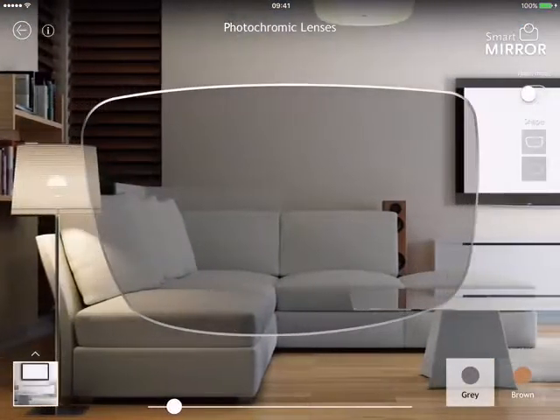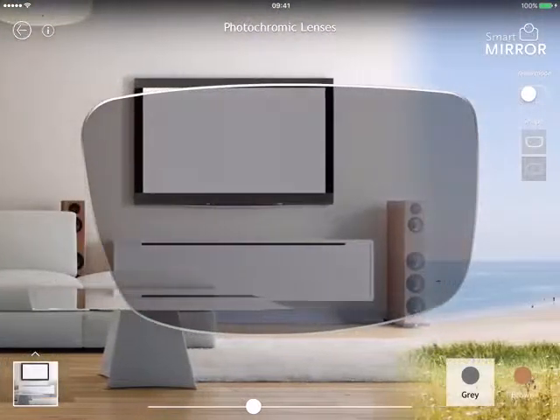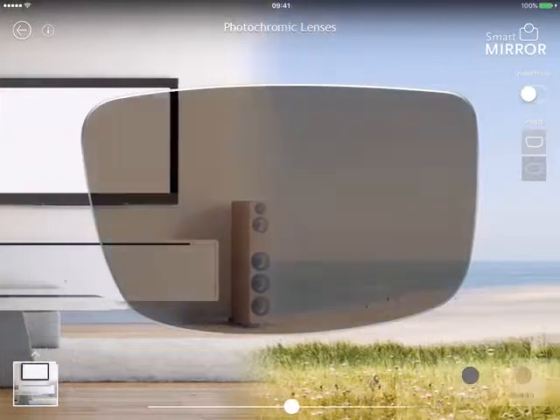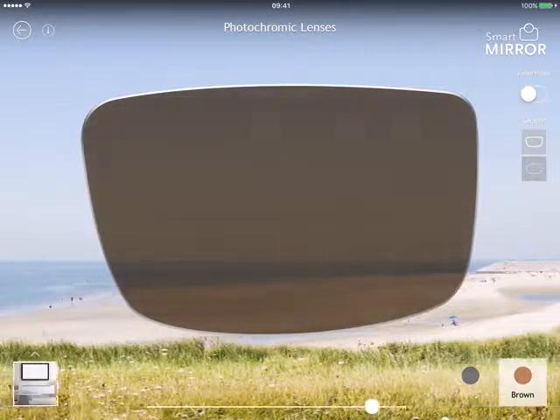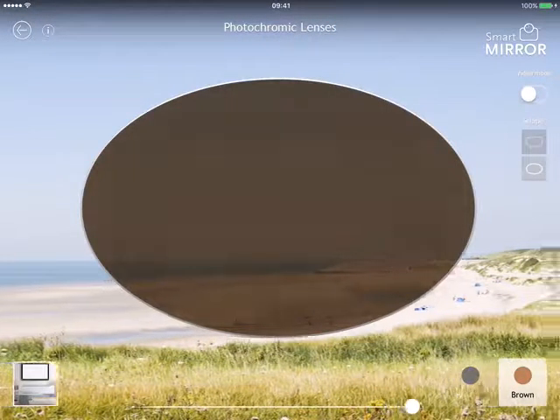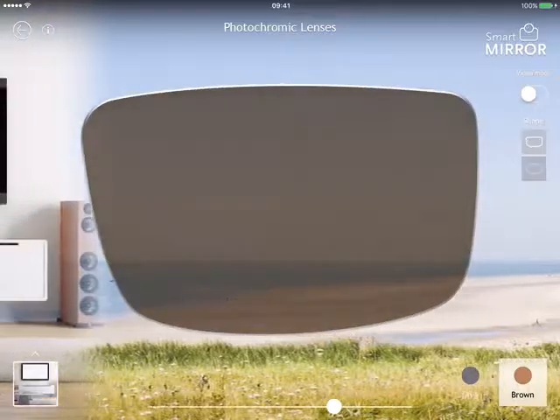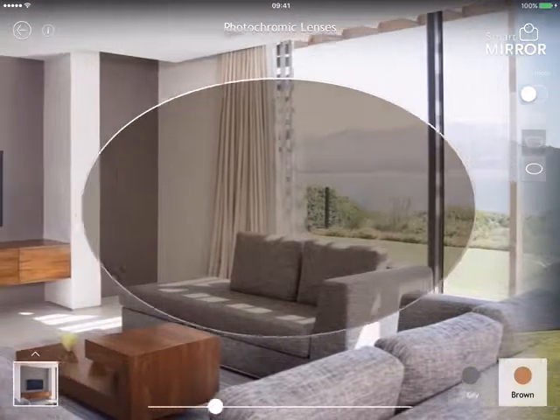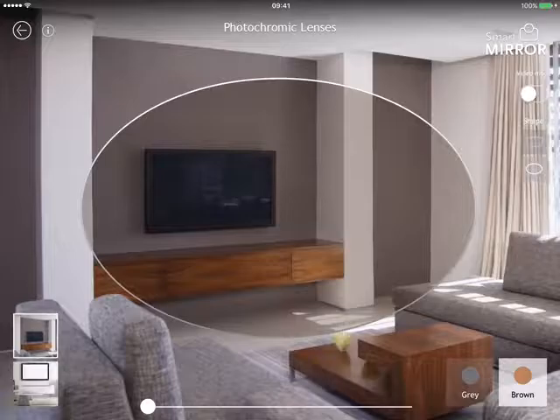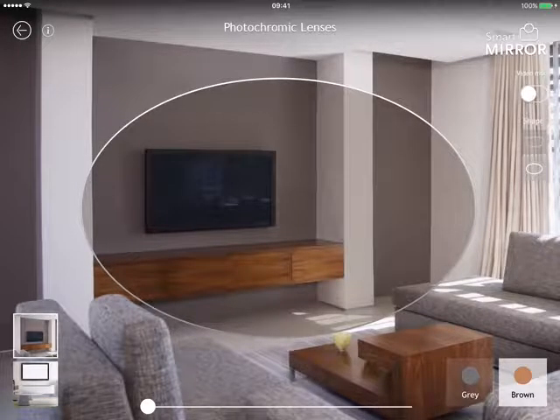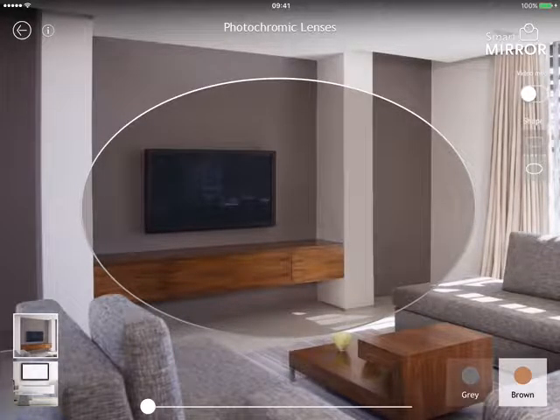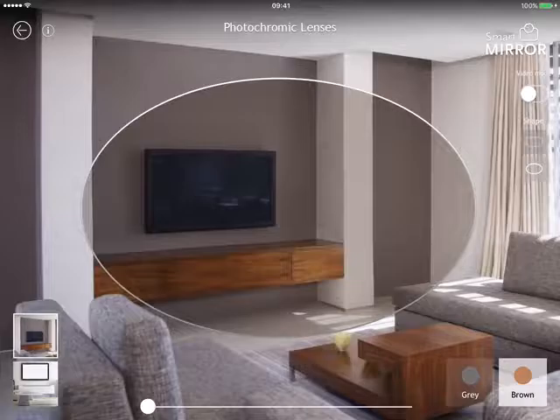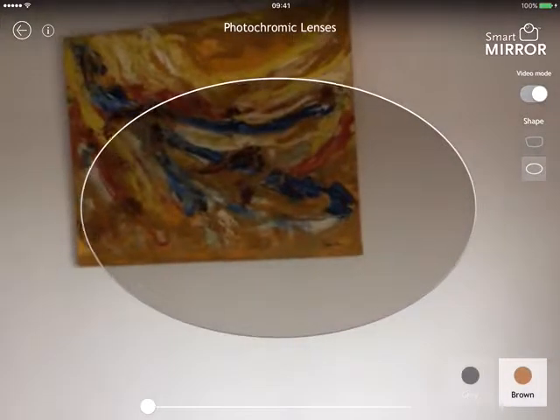For photochromatic lenses, we have two color options — grey and brown — and two lens shapes. We have two images and you can also run this in a video mode, showing the customer in a real life situation. So let's go to video mode.